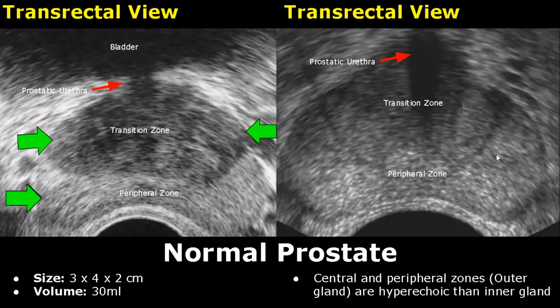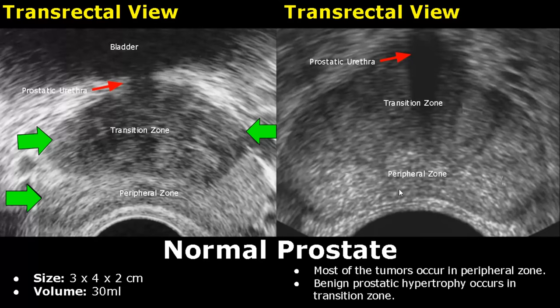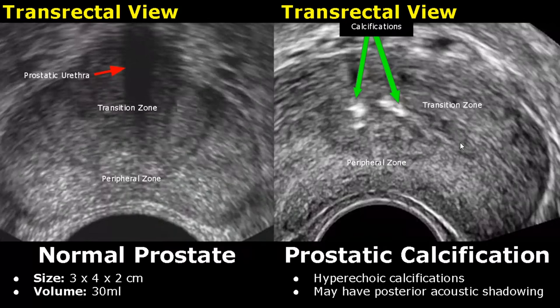Most of the tumors and cancers occur in the peripheral zone, and benign prostatic hypertrophy mostly occurs in the transition zone. Calcifications in the prostate appear hyperechoic and may have posterior acoustic shadowing if the calcifications are large enough.